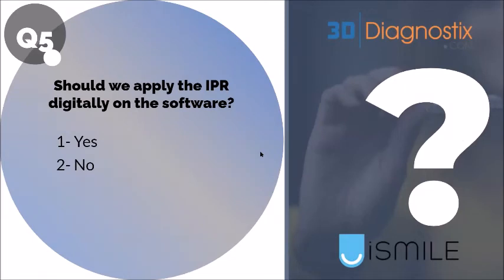So here's another question. What do you think? Should we apply the IPR digitally on the software? Yes or no? We have 70% saying yes, and 30% saying no. The correct answer is no. We never add the IPR digitally on the software.